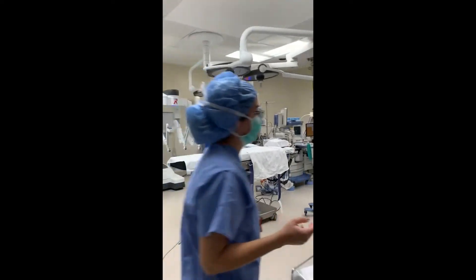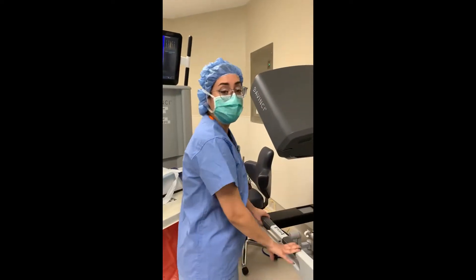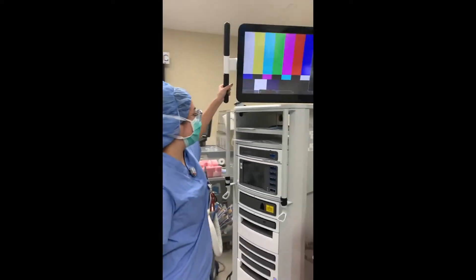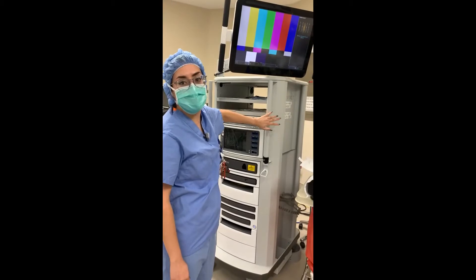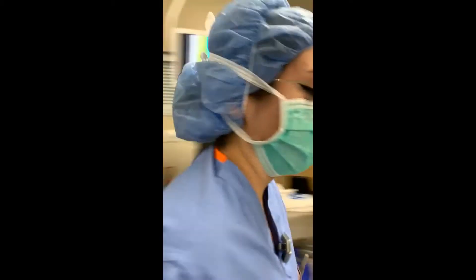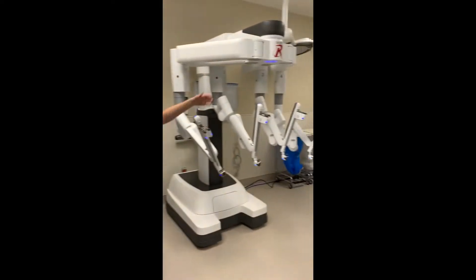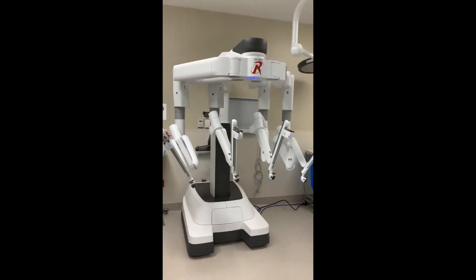The robot comes with three components. We have the surgeon console, where the surgeon actually performs the procedure. The patient tower, which allows us to plug in our instruments and do the surgery while we work on the field. And the robot itself, which has full arm movement and allows us to do surgery.